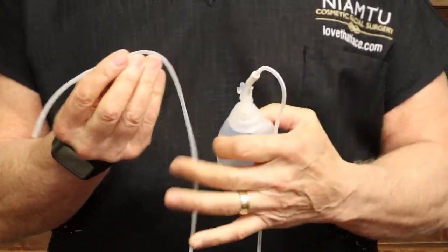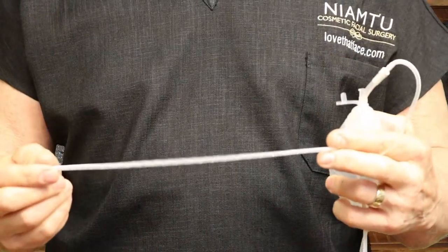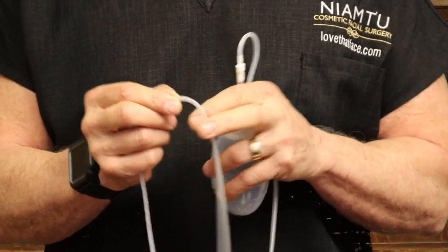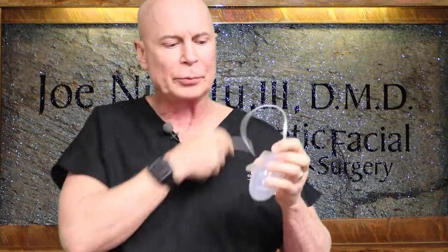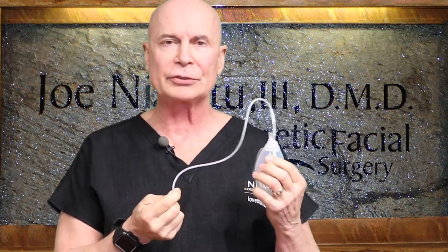This is called a Jackson Pratt drain. The area I'm holding between my fingers has a bunch of little holes in it, and this portion goes in around the patient's neck where we do the facelift. This part will protrude at the hairline and there's a tube on here — you can put it in your pocket, there's a little loop you can put around your belt, or you can tape it to your blouse. It's not a problem, and the patient really doesn't know it's there.